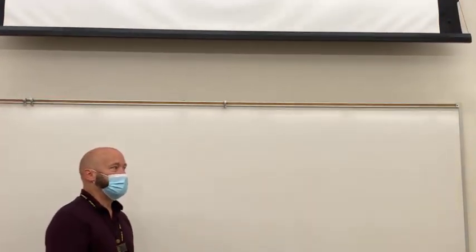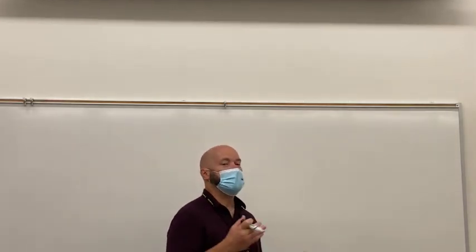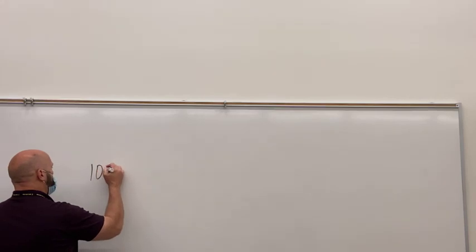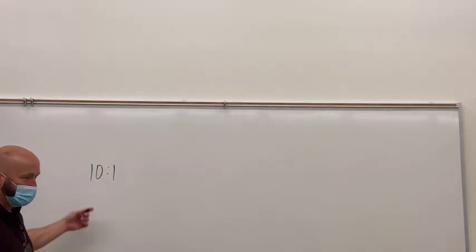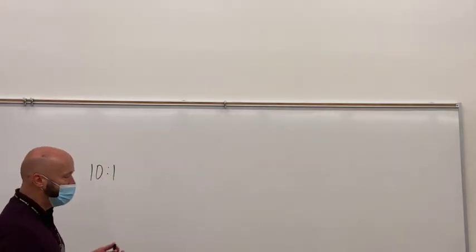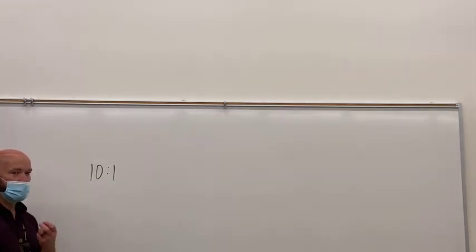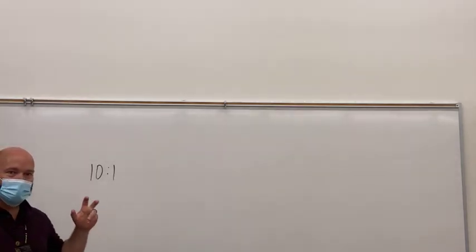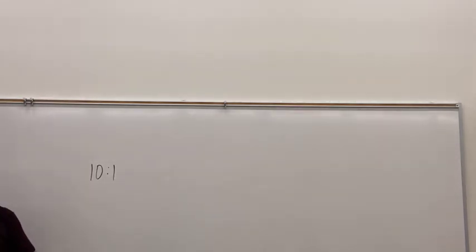Grid ratio really is the defining thing in measuring grid effectiveness. And again, most of your grid ratios in your table are probably going to be 10 to 1. Maybe 12 to 1, maybe 8 to 1, probably 10 to 1. If that is really the ideal grid ratio, we didn't want to lose it, but we had the problem with the moire artifact.